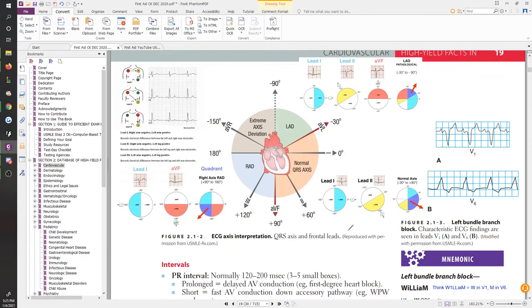If you look at this, pretty much a compass in a sense, this is where they break down the axis information for you. This is how you create axes for a heart, okay? It's also based off of the same leads that you've been looking at, so you have your different leads being placed onto here. And your general 90-degree angle is actually going to be this area right here, okay? This is your normal QRS axis area. The normal QRS goes all the way from AVL to AVF, okay? But the 90-degree area is here. So this entire orange area that they've highlighted is your normal QRS axis.